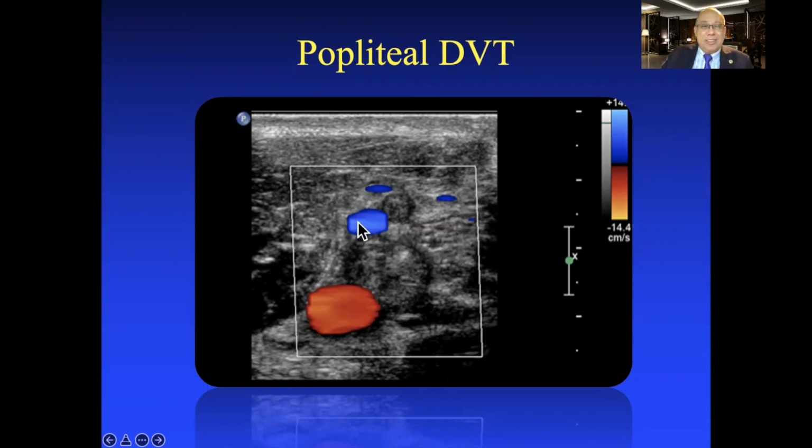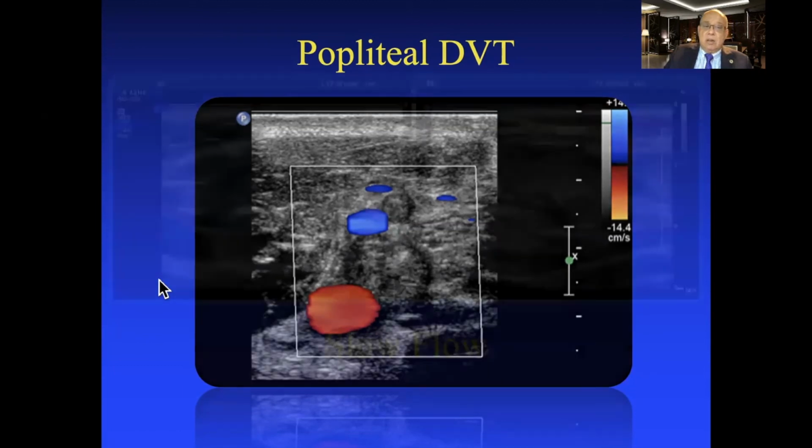But look inside, the other muscular vein is occluded, is occupied with this medium echogenicity, with some parts with higher echogenicity in the interior, with negative Doppler signal. And of course, the compressive maneuver was positive. It was impossible to compress those vessels. So recent and an old thrombus.